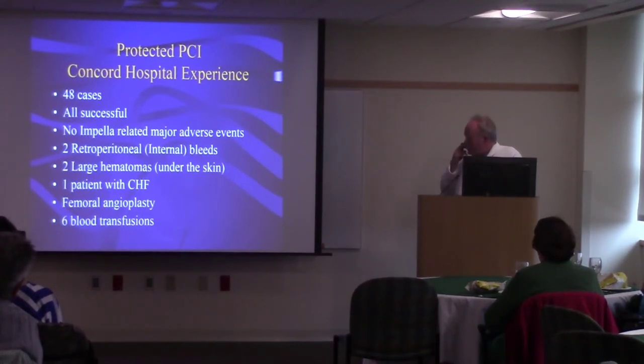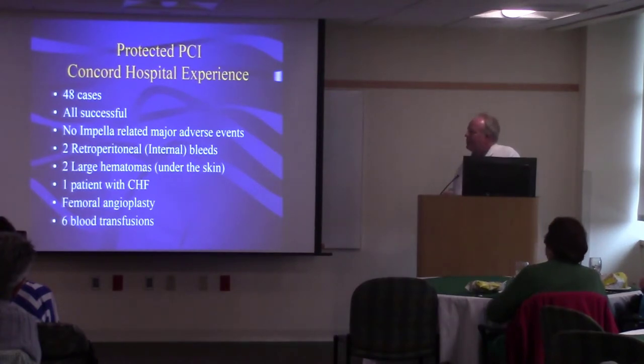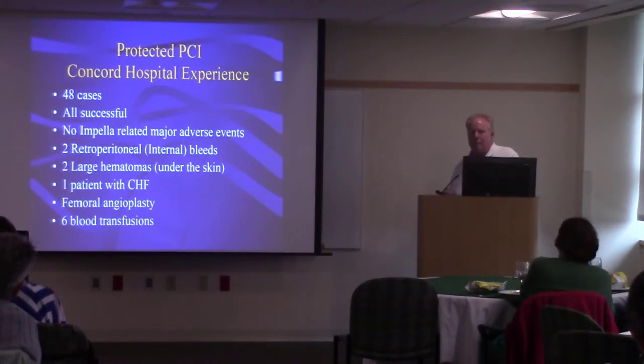So the past 2+ years, we've done 48 patients this way. All of our cases have been successful. We've been able to open all the blockages that we've worked on. We've had no major adverse events related to the Impella itself. Some patients have had adverse outcomes, but it wasn't related to the Impella. It was related to maybe another medical condition that they had, like bad kidneys or bad lungs, but it had nothing to do with the Impella or the work that we did on their heart.